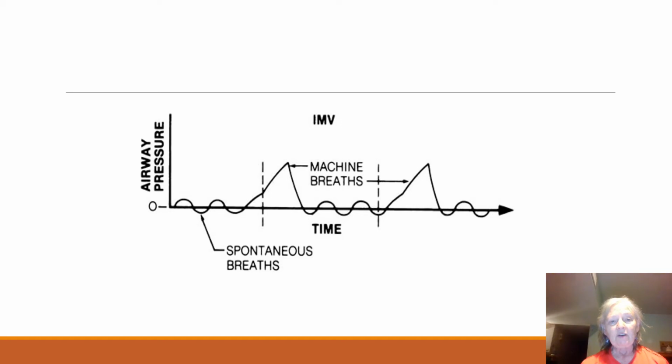But here's another graphic for you to see. As you can see, the spontaneous breathing. You can see this where the little dash line is at that particular point. Let me grab my pointer here so we can see with this dash here. This is where breath stacking would occur. Here's the patient's breath. Here they hit the mandatory timeline. There, in fact, now is the machine breath. We go back, as you can see, they went ahead and tried again. Guess what? They went ahead and banged into that same window. As a result of that, they got another machine breath on top of their spontaneous breath.